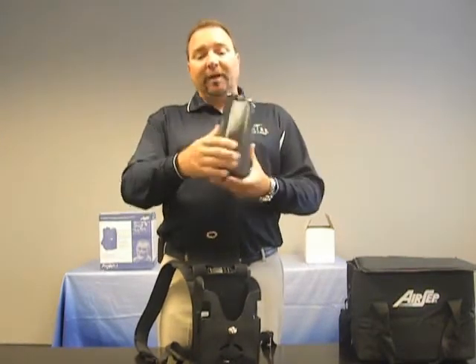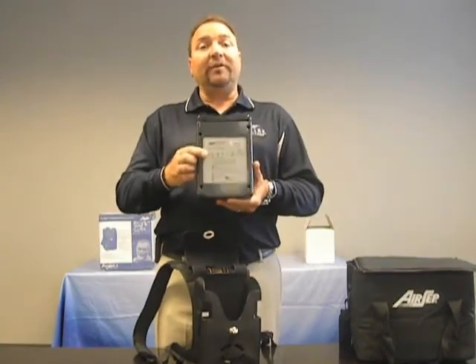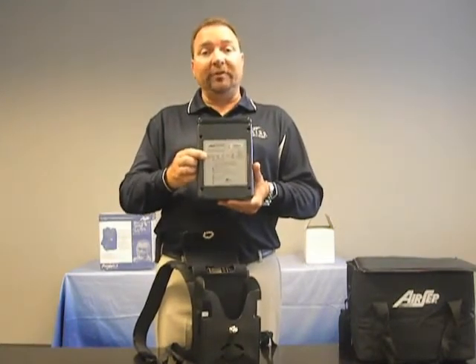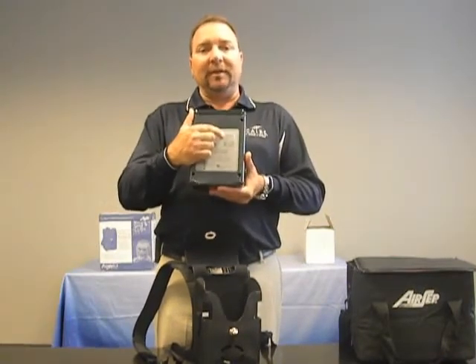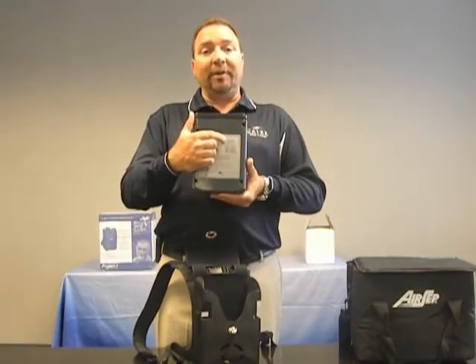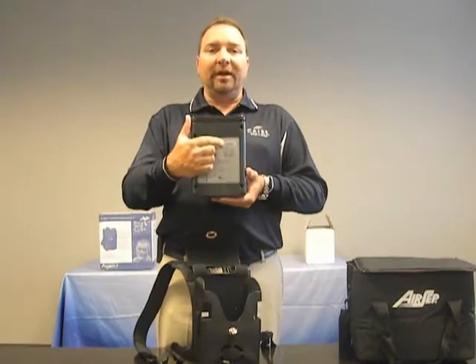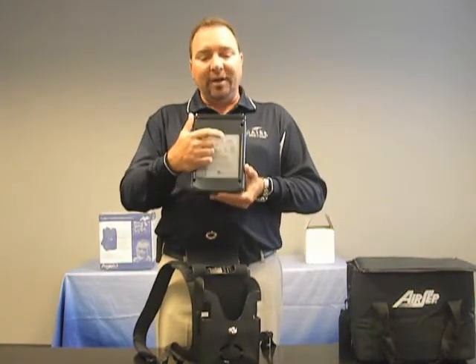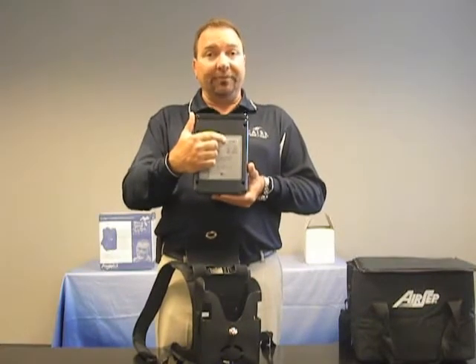By turning the Freestyle around you will see labeling that indicates the Freestyle does have FAA approval for use onboard aircraft. In addition, it's important to note that every Freestyle includes a serial number. The serial number is important information to have available. In the event that service is required, you can contact your current oxygen provider, provide them with that number, and they can give you information regarding warranty coverage.